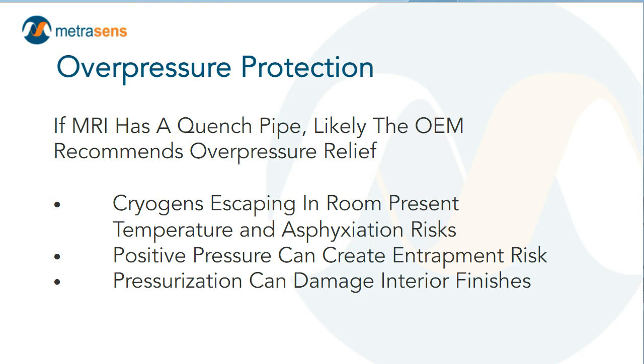If cryogenic gases, liquefied helium, turns to gas and escapes into the MRI scanner room, we have some pretty significant risks to patients and or staff. There is temperature and asphyxiation risk. The increasing volume of the gas will positively pressurize the room.